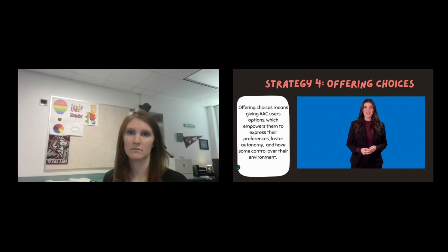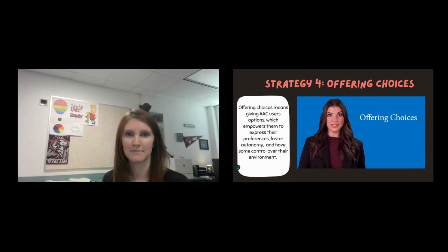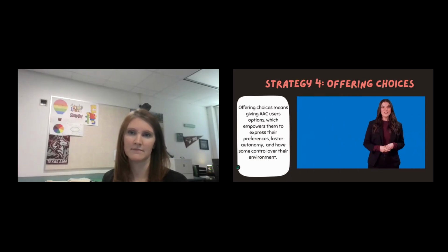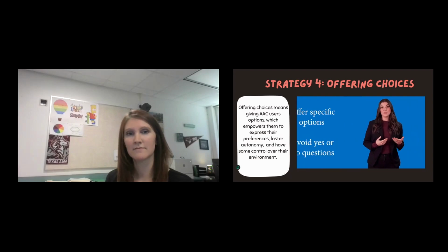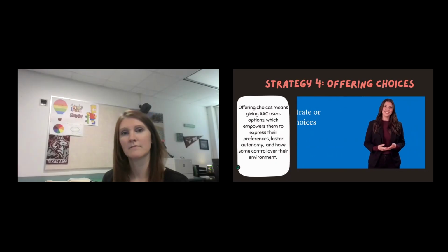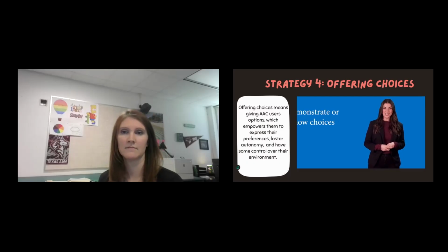Today we are going to practice offering choices on the AAC device. By offering choices and modeling those choices on the AAC device, you can help your partner practice communicating their preferences and increase their vocabulary. When offering choices, you will want to offer specific options and avoid questions that are just yes or no answers. When you offer choices, you can also demonstrate or show the choices to help your partner to understand what the communication means.